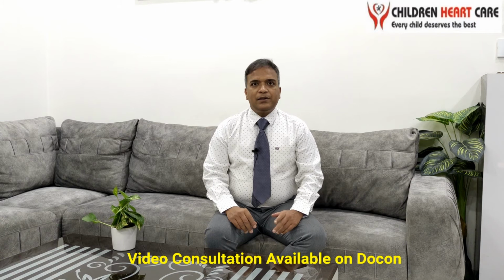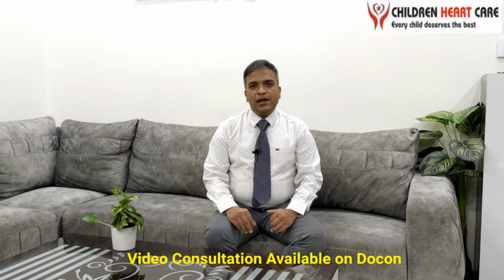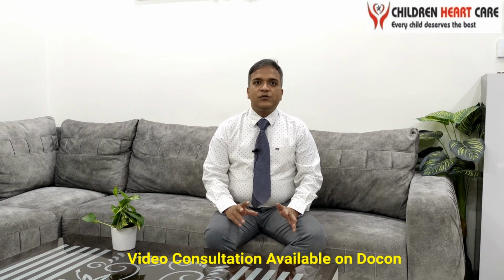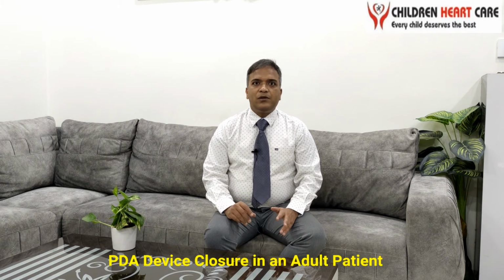We evaluated the patient because we could not measure the size of the PDA on echo. We advised the patient to undergo a CT scan. On CT scan, we measured the size of the PDA was 8 mm. That is very big. And fortunately, this patient is still operable, meaning we can do something for this patient. Otherwise, an 8 mm PDA generally goes into an Eisenmenger-like situation within the first 2 years of life. But God was great, and this patient was operable.